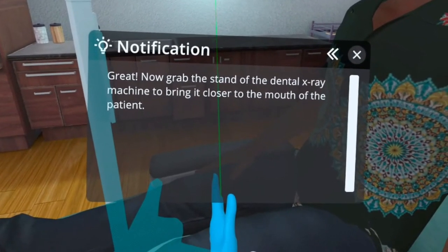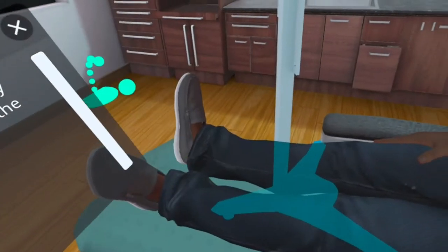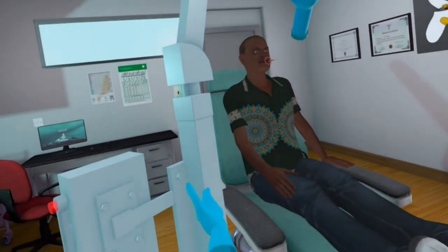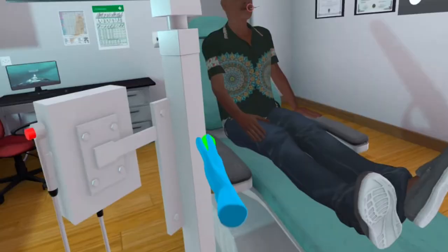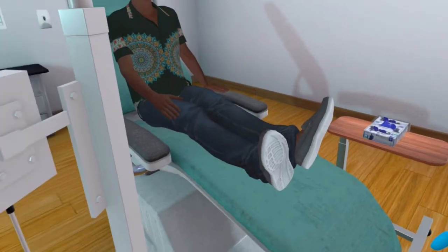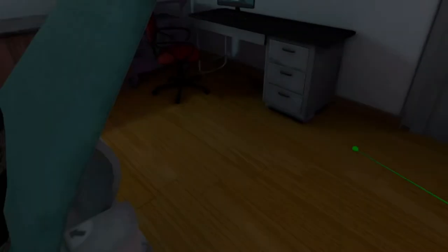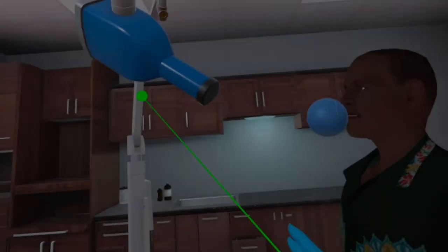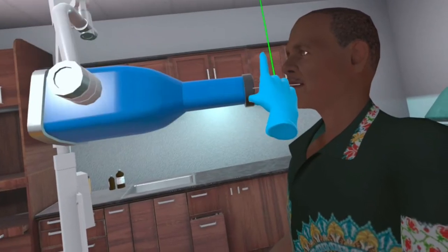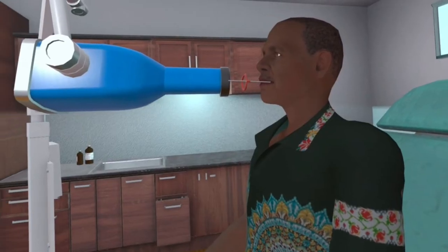Great. Now grab the stand of the dental x-ray machine to bring it closer to the mouth of the patient. Okay. Now grab the x-ray machine to set the angle to collect a dental image of anterior teeth. Very good.